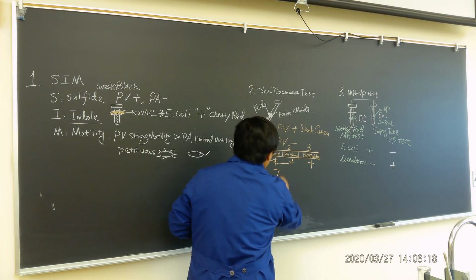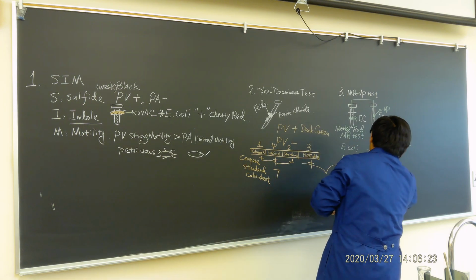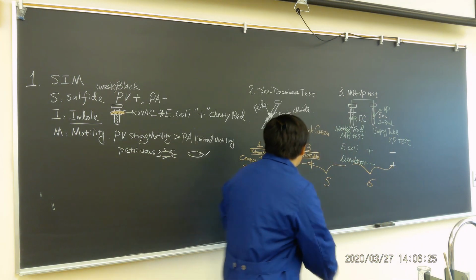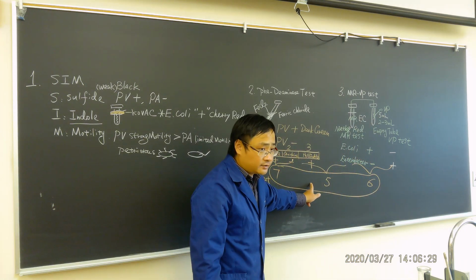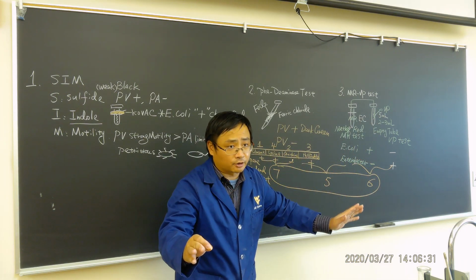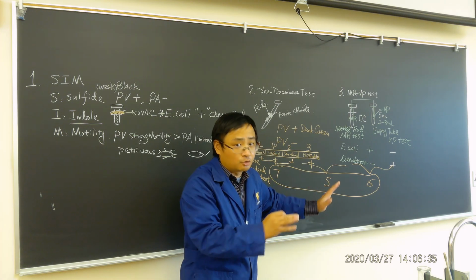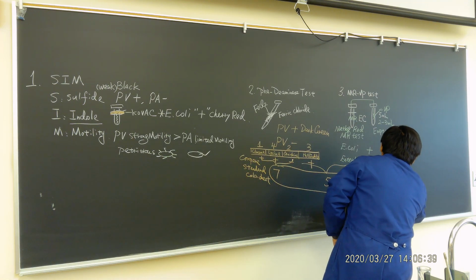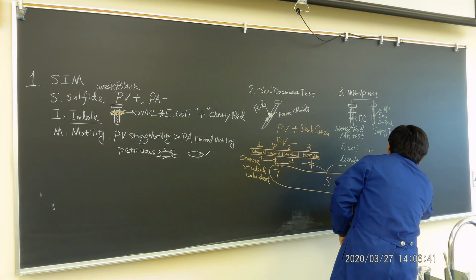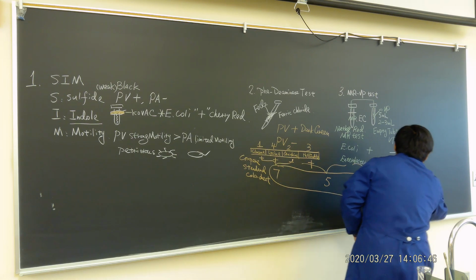So this maybe adds up to 7, then here maybe 5, then another 3, maybe 6. This will be your standard code. And this standard code, you have to compare to a code book. If it's matched, which means the species, the genus will be matched. Okay, so use these to compare a standard code. I just tell you how to do it. We don't have to do it.